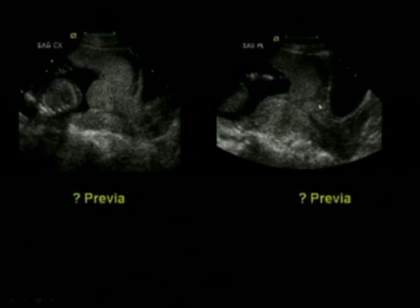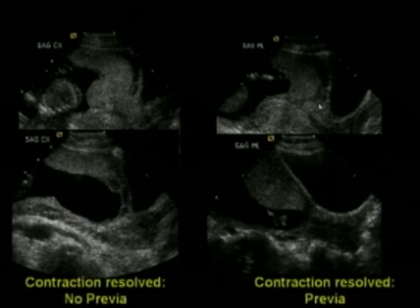Here's what happened on these two different cases when we waited for the contraction to go away. Here on the case on the left, this looked like a previa, but when the contraction went away, there's the cervix, placenta ends here, it's not a previa. In this case, it looked similar during the contraction. When the contraction goes away, you can see that the placenta covers part of the cervix, right up to almost the internal os. So this is a low-lying or marginal placenta previa.